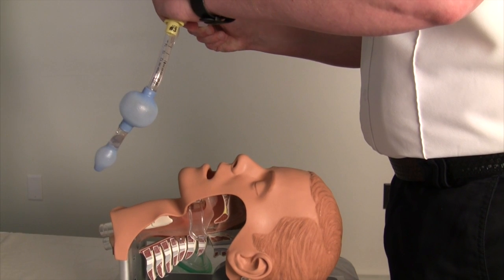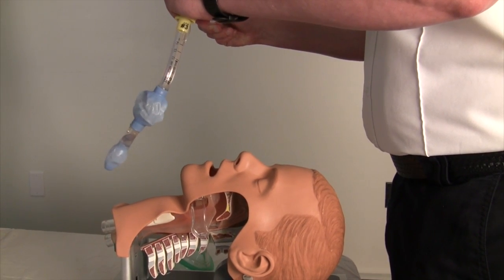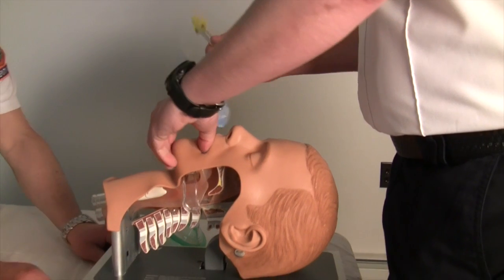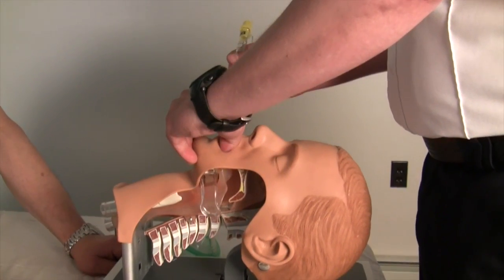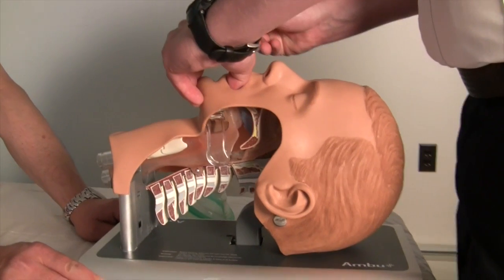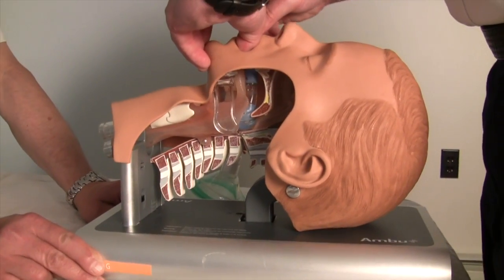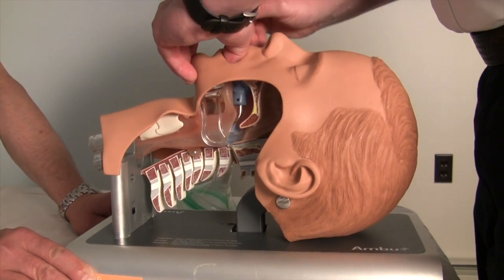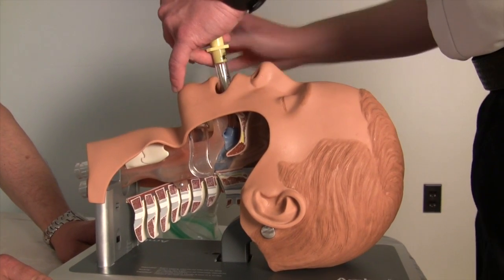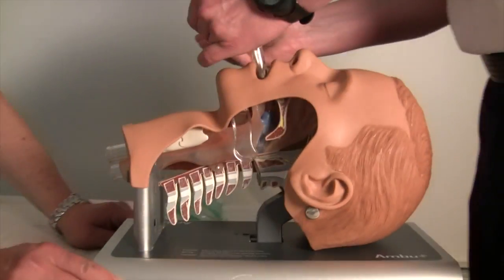The King is held with the dominant hand, and the other hand is used to hold open the patient's mouth and apply a chin lift. With the King rotated laterally 45 to 90 degrees so that the blue orientation line is touching the corner of the mouth, introduce the tip into the mouth and advance behind the base of the tongue. As the tube passes under the tongue, rotate it back to midline so that the blue orientation line faces the chin.